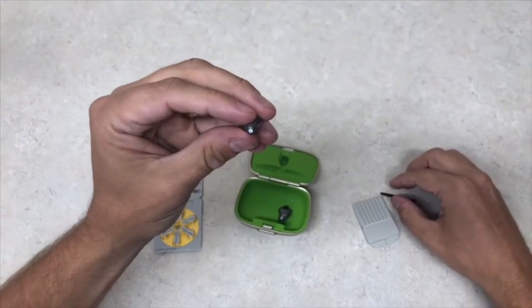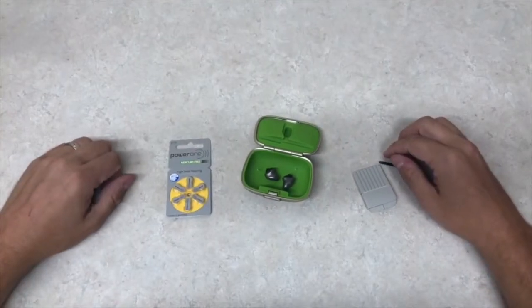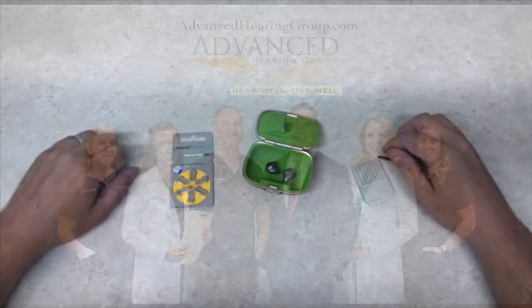If you've changed the wax trap and changed your batteries and your hearing aids still aren't working, it's time that you contact your hearing healthcare professional.